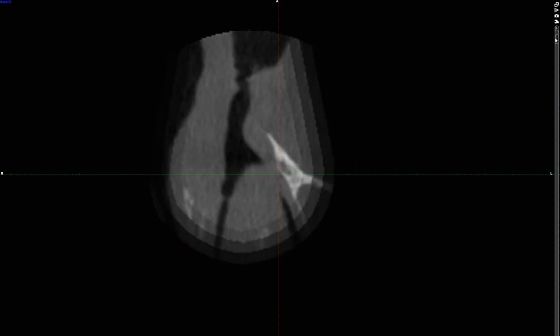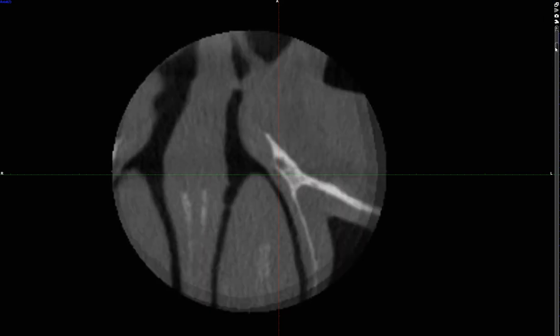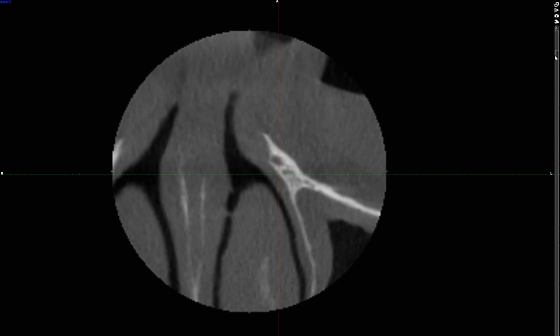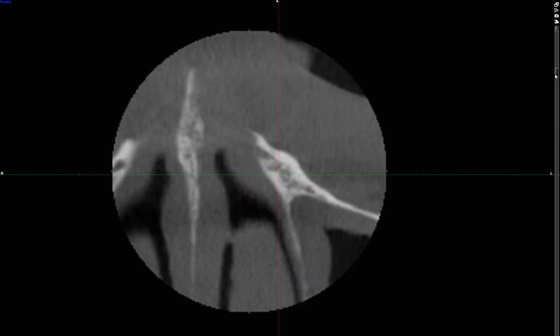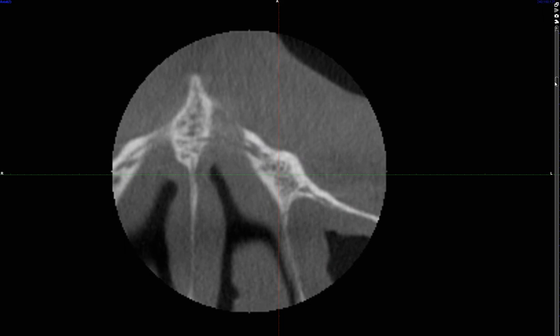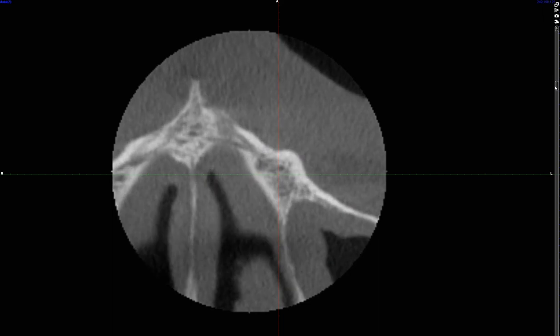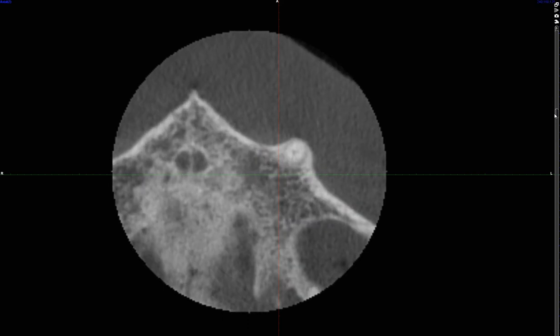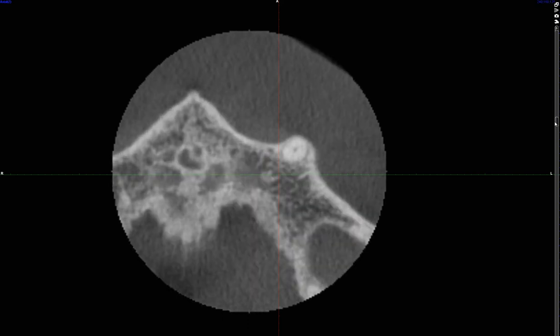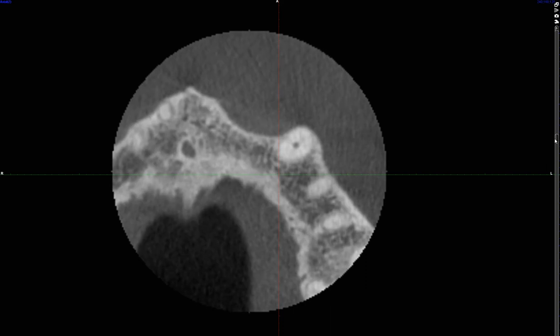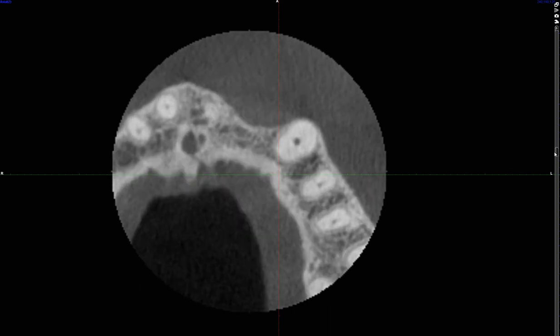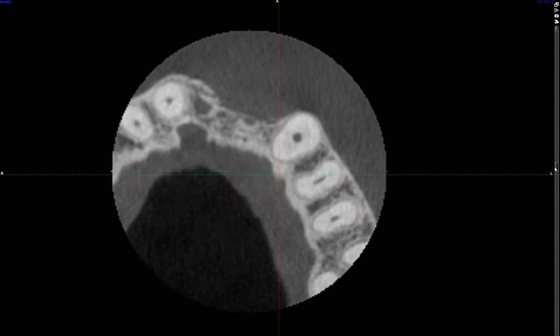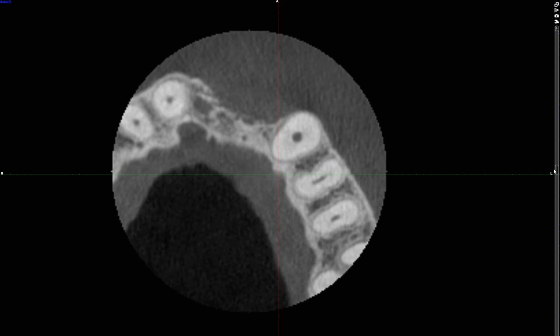I haven't even gone through the anatomic video of CBCT, so I understand if you feel overwhelmed or unable to orient yourself — you will get there. The more you watch this video, I'll make sure you'll get there. But for now, I want you to notice that this patient is missing some teeth, and that is the reason why this was taken.